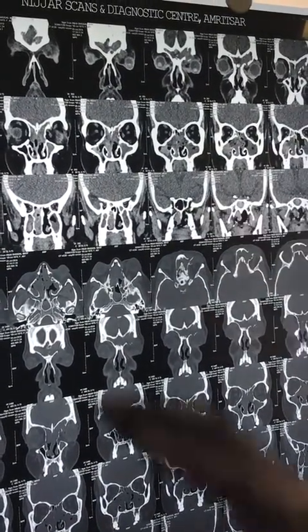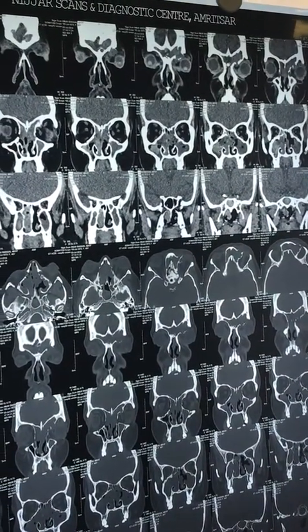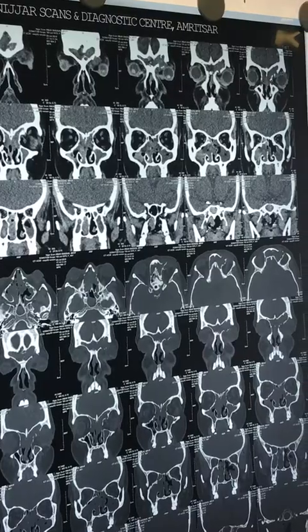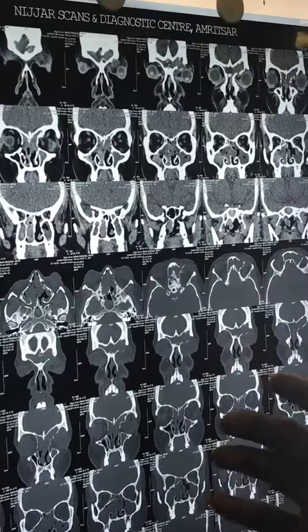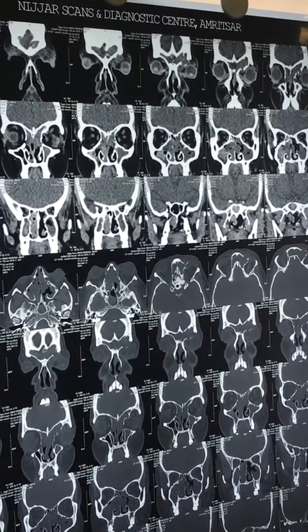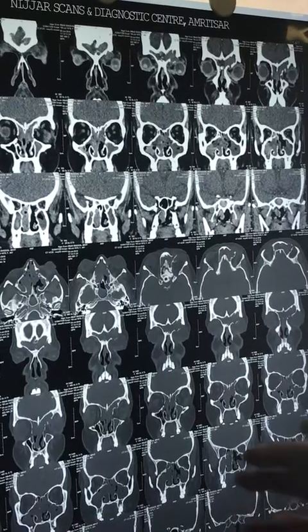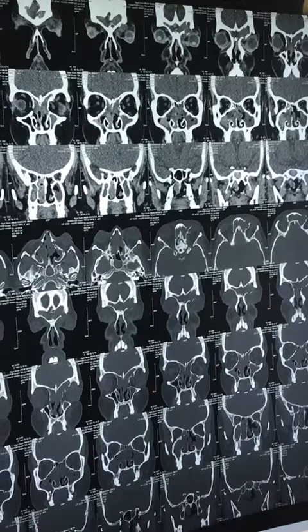But any fungal disease which is completely occupying the sinuses, the sinuses are full of disease with a little bit of extrasinus extension, this is non-invasive because of the expansion, erosion or previous surgical treatment. Primarily an invasive fungus will have minimal intrasinus component and maximal extrasinus component. This is the basic. Secondly, to diagnose further, MRI is the answer for most of the head and neck diseases.